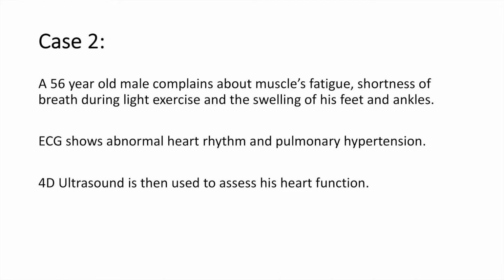Now, we will be looking at a more complicated scenario. A 56-year-old male complains about muscle fatigue, shortness of breath during light exercise, and the swelling of his feet and ankles. An ECG shows abnormal heart rhythm and pulmonary hypertension. 4D ultrasound is then performed to assess his heart function.